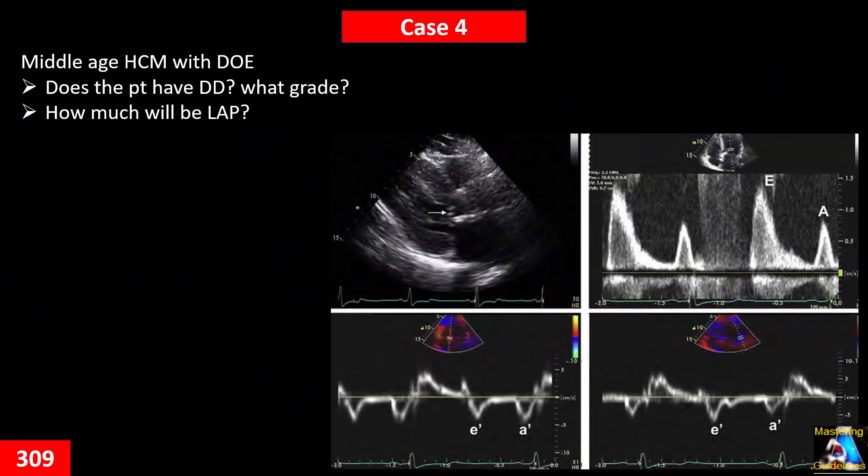Case four: a middle-aged patient with hypertrophic cardiomyopathy and exertional dyspnea. Does the patient have diastolic dysfunction or not? What grade? And how much do you guess the left atrial pressure most probably will be in this case?